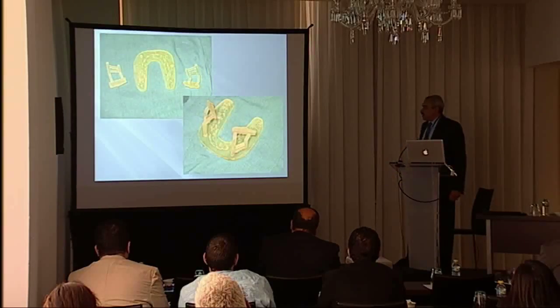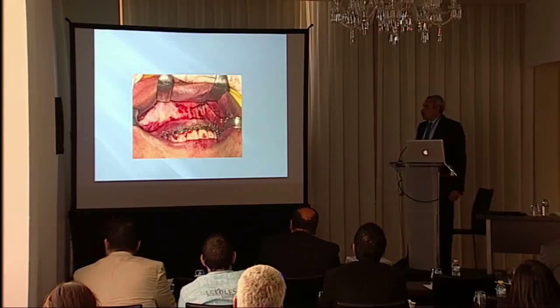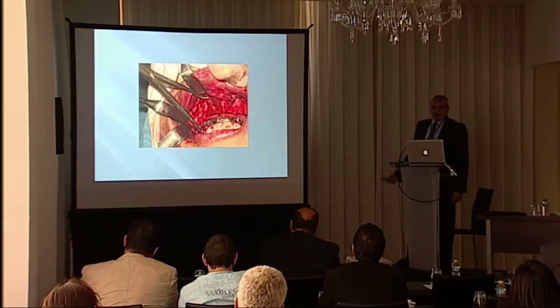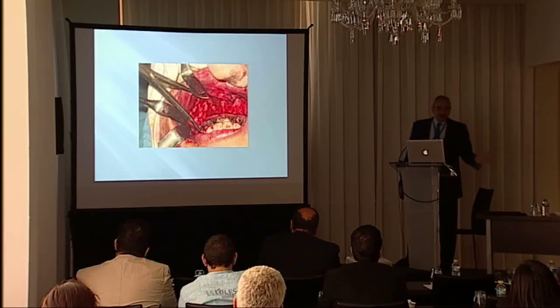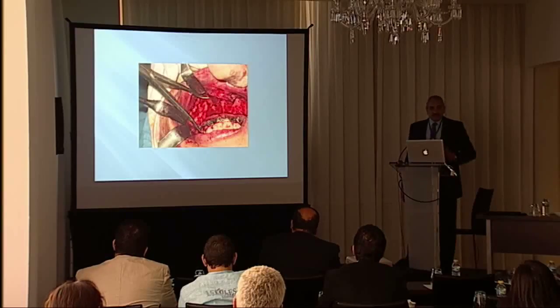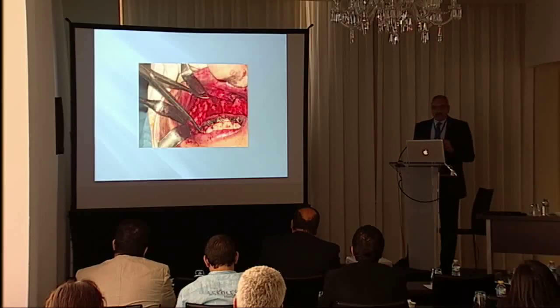This is the shape of the splint in pieces. And now here we open the cut. The tissue is open. I started by doing the classical measurements that we do without the computer-guided splint. I still do it. I was a little afraid that one of my splints may not fit, so I can continue in the conventional manner.